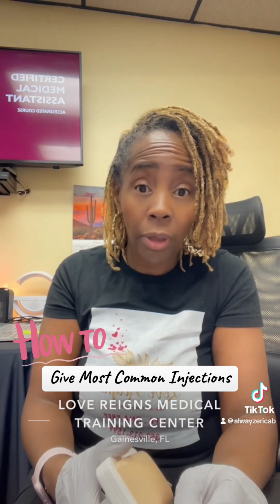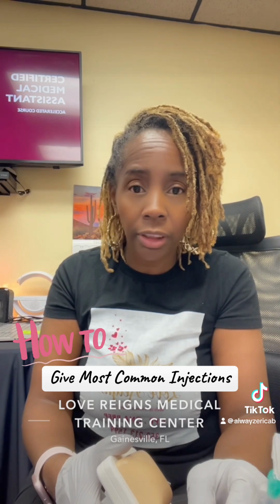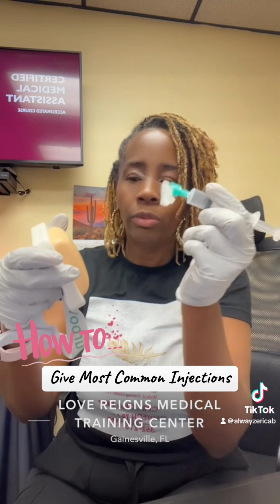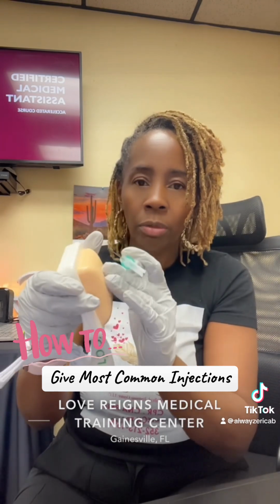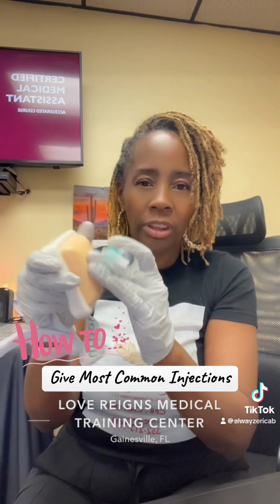So they're probably going to do a whole incident report and write you up if you make that mistake because of the cost of that medicine. So I'm just saying be very careful that you don't put your finger on the plunger. You want to put your finger here and then push that medication in and come straight out. And then we want to massage that in. Some of that medicine's a little thick and it can cause a knot under the skin. So kind of rub it in a little bit.